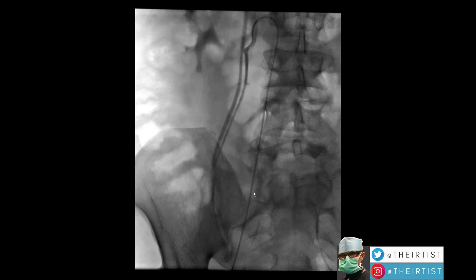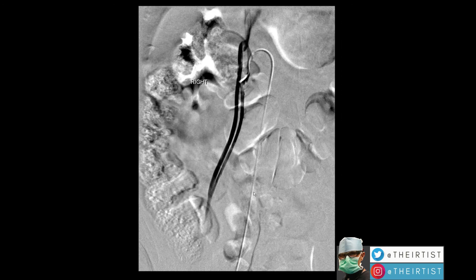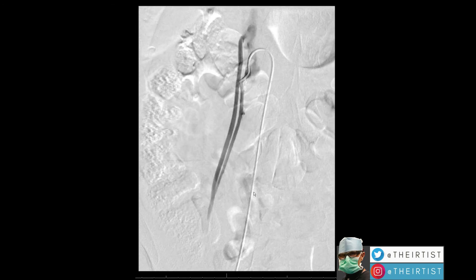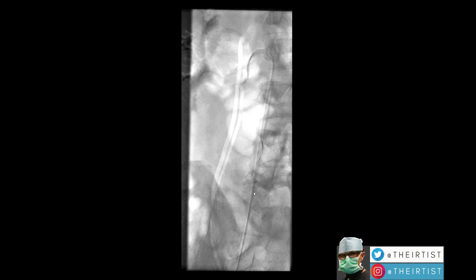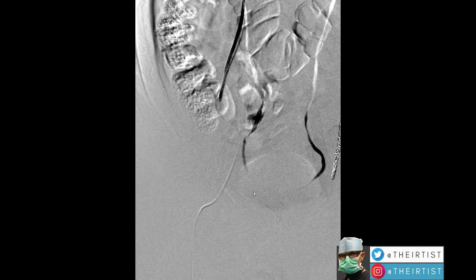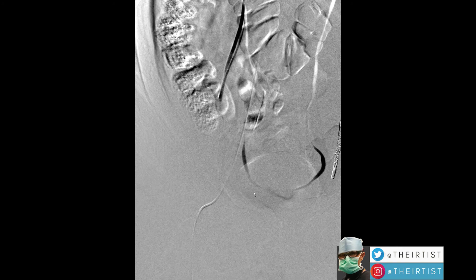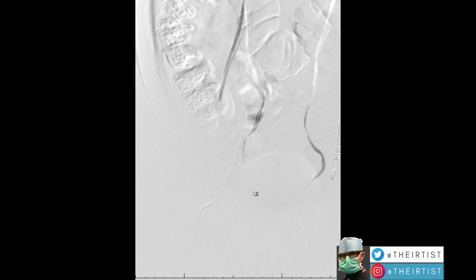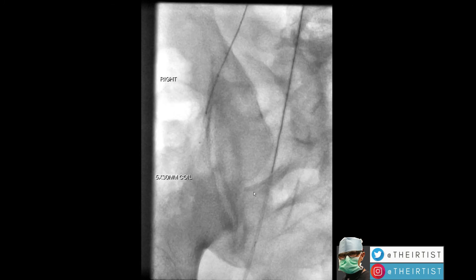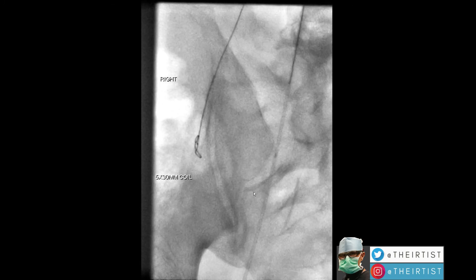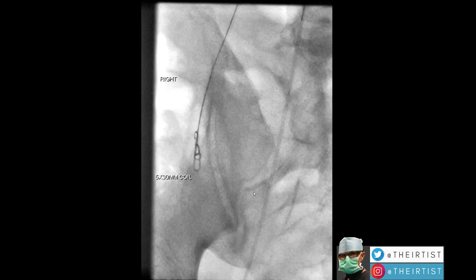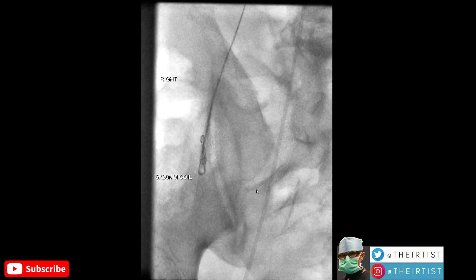In this case, the patient had more symptoms on the right than on the left. You can see two big veins draining the right testicle. We enter again with the micro catheter technique, get to the appropriate location, and perform an embolization with coils. Here are the coils being deployed at the level of the spermatic vein.